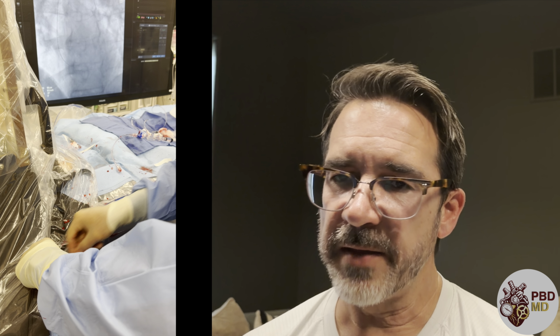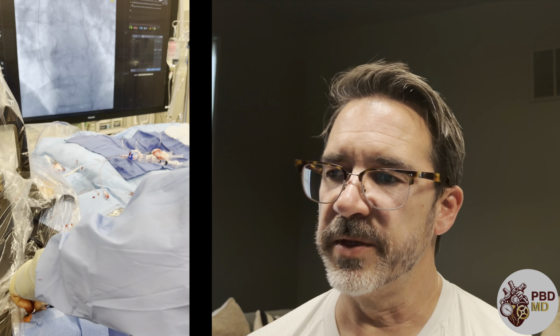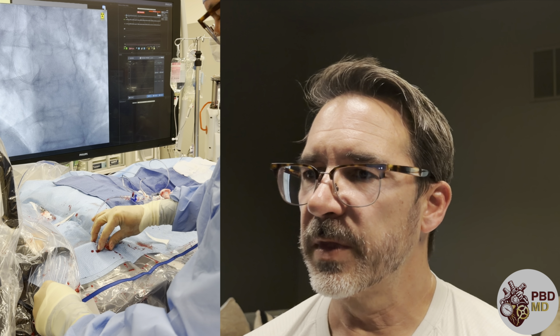And we have different shaped catheters for different arteries and different anatomies. We have quite a selection, but there are a couple standard ones, and those are the ones that we use in this case. What's called a right 4 and a left 3.5. And so again, we just torque the catheter a bit and connect it up to the pressure line. In addition to injecting contrast with this setup, we're also flushing the line and measuring pressures. That gives us a bunch of information all at once. We're also keeping track of the EKG at the same time.